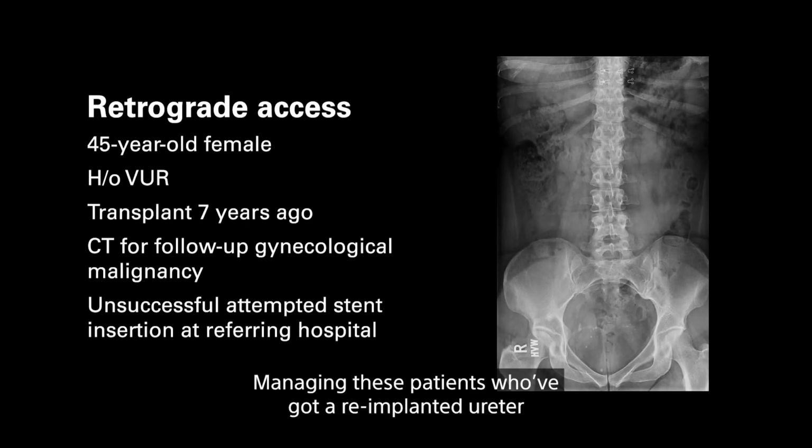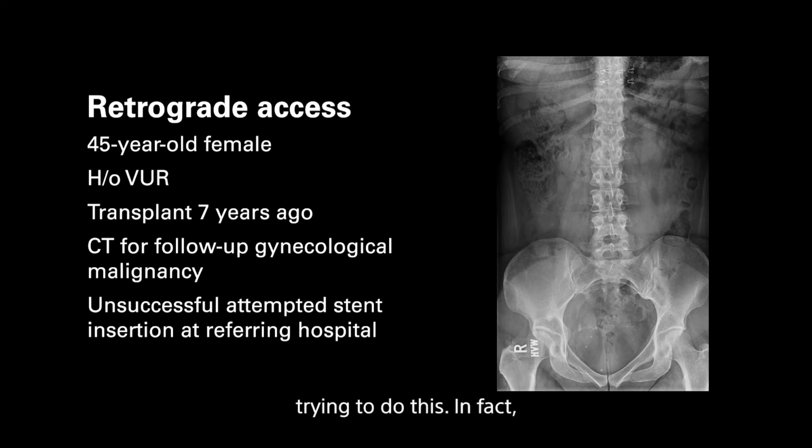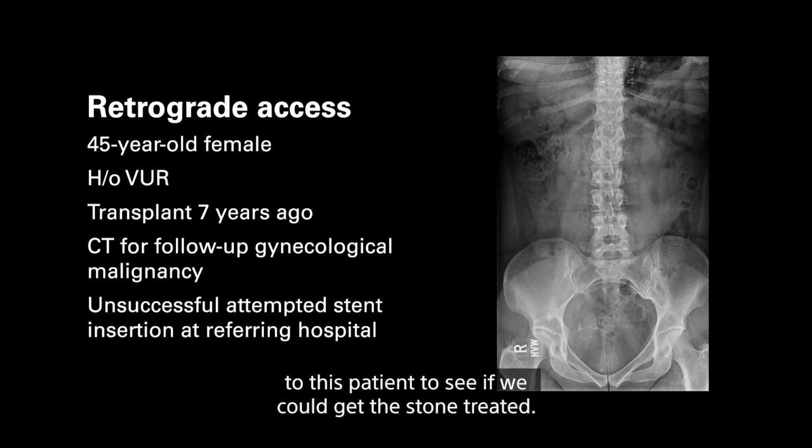Managing these patients who've got a reimplanted ureter can be challenging, but I think it's certainly worthwhile trying to do this. In fact, a colleague at another hospital had attempted stent insertion on this patient and found that it wasn't possible, but we thought that we would attempt retrograde access to this patient to see if we could get the stone treated.